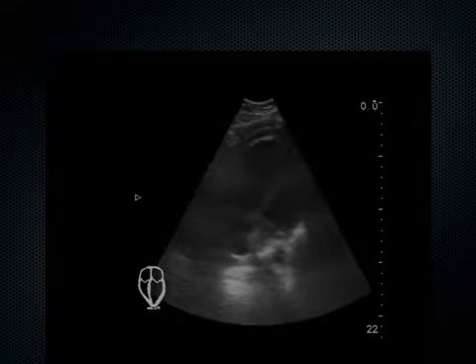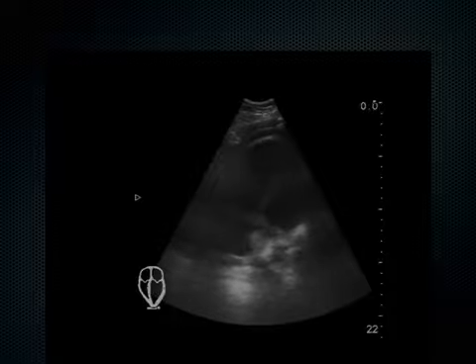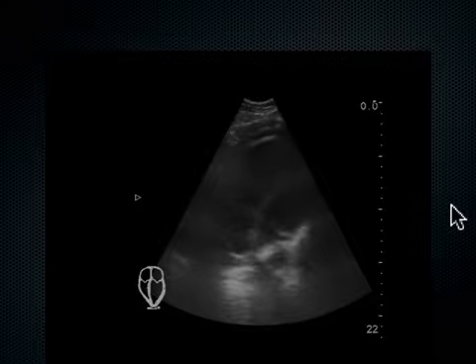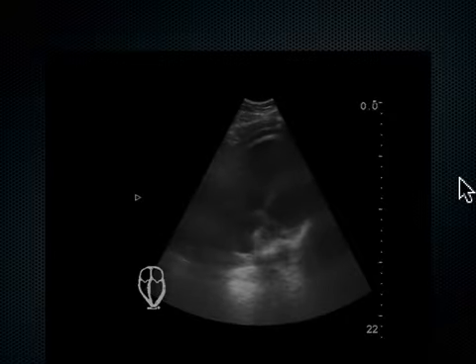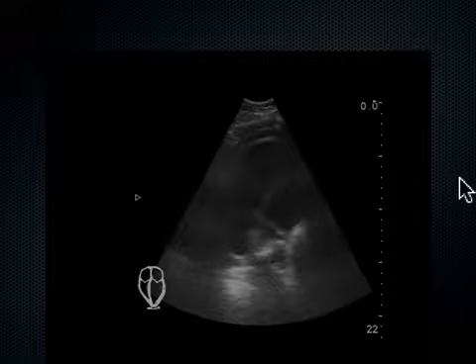This was an employee of the hospital who had an external fixation device on his leg, a 41-year-old male. He went home after orthopedic surgery. Two days later, he came back in full-blown cardiac arrest, PEA. We're doing CPR on him, and we saw his heart with no pulse. Now, about 30% of the time, you don't feel a carotid pulse, but you actually see this amount of cardiac activity. This is called PCM, pulseless cardiac motion. It tells me the patient's still alive, okay?